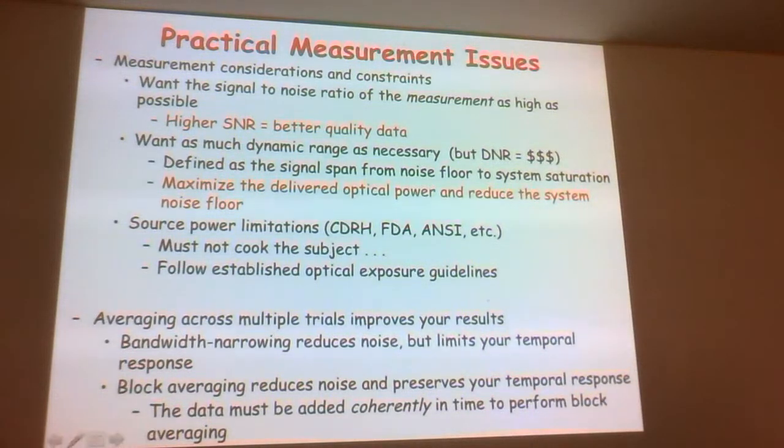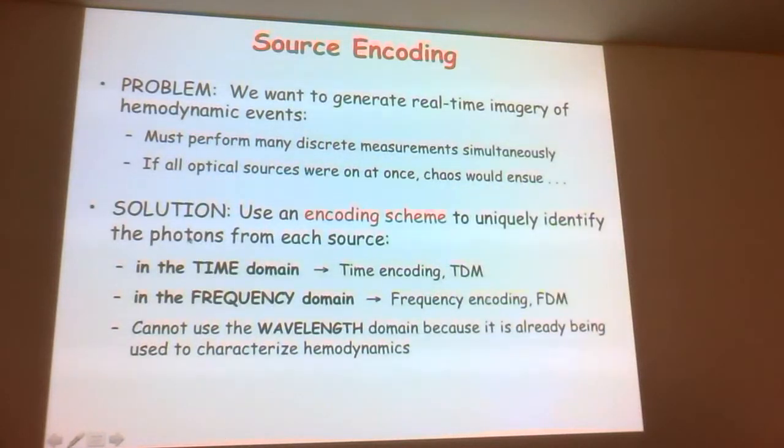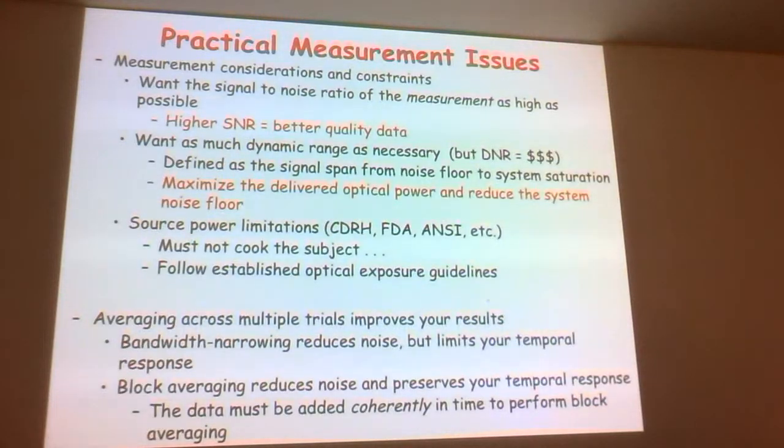And of course, we are limited on source power. We can't put watts onto tissue because the tissue would burn. So we're limited to tens of milliwatts so that the tissue doesn't heat up in the near infrared. Of course, if you go to green light and blue light, you have to use even lower powers. But we would never do that for these measurements because, remember, the absorption is so high the light doesn't propagate very far through the tissue.